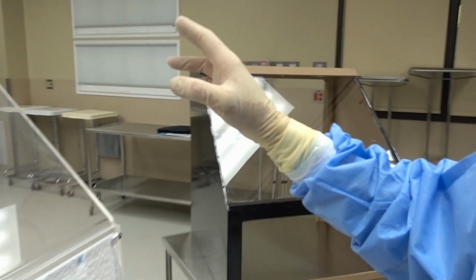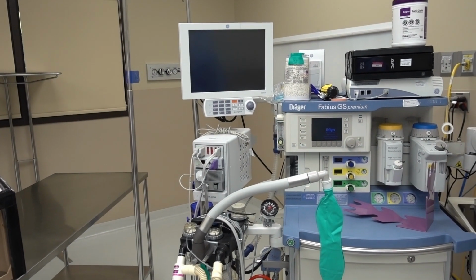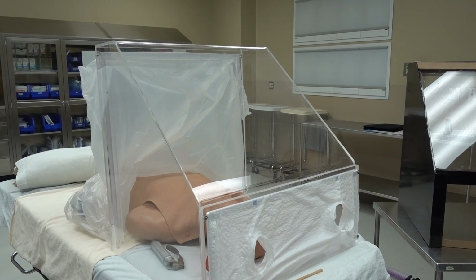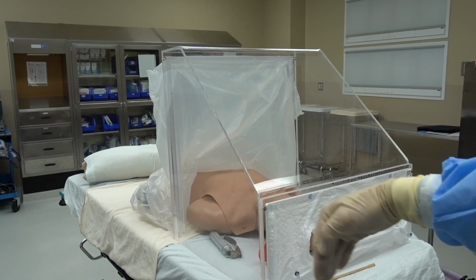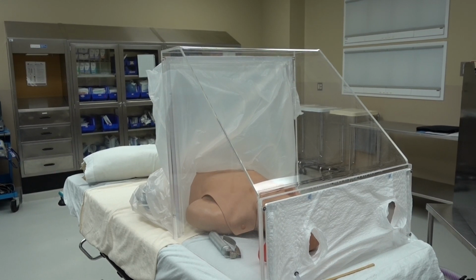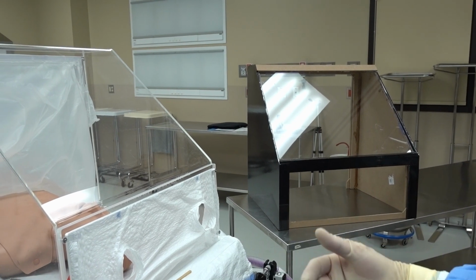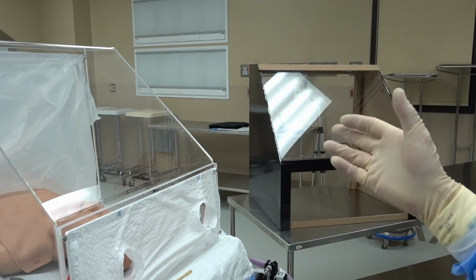We rolled the bed all the way to the end of the room. We covered up all the machinery here, so we didn't spray their machines. I don't think they'd have been real happy. And we did another test, and it was quite interesting. 1 cc of fluorescein with a good cough. It spread fluorescein approximately 9 feet from the head of the bed, or about 9.5 actually, towards the machine, 2 feet behind the bed, and we'll have those videos to show you, or we'll splice it into this video to show what it looked like. But it's quite impressive how much aerosol is delivered that way.